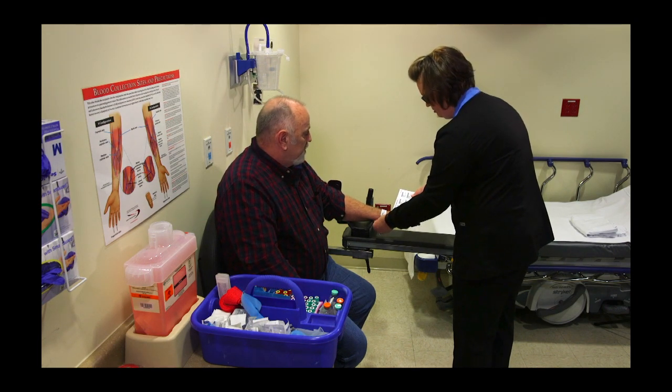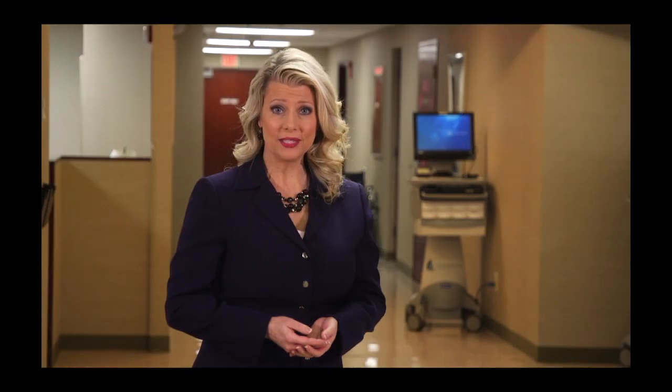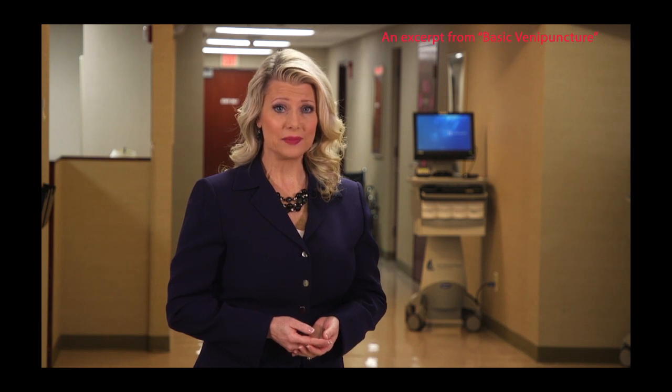Notice how the phlebotomist asks the patient to state his full name and birth date and spell his first and last name. Many patients have similar sounding names. That's why simply asking them to confirm the name you verbalize is not sufficient.